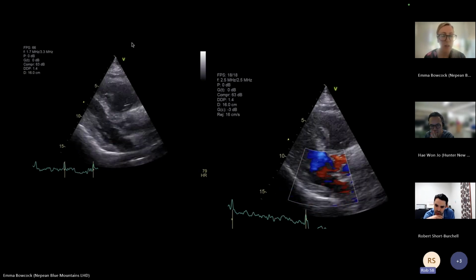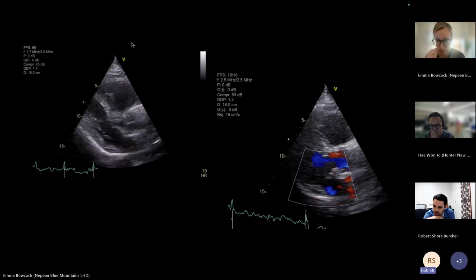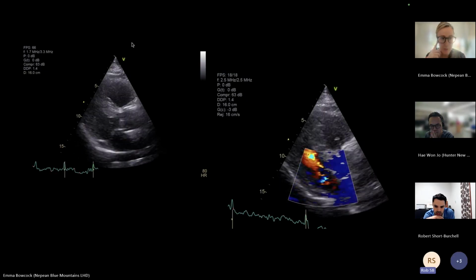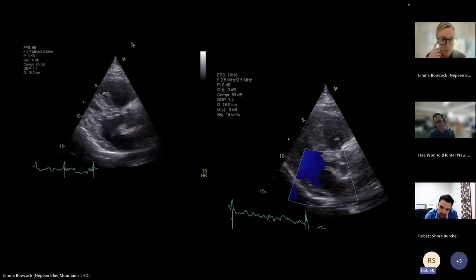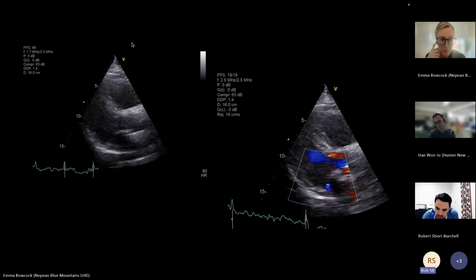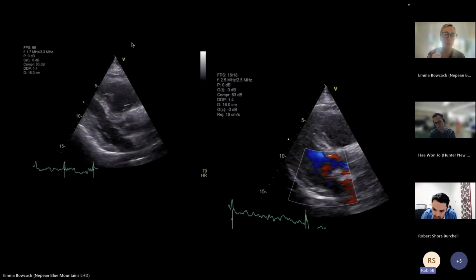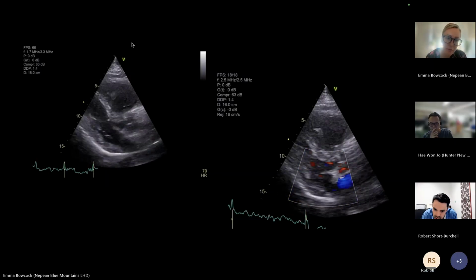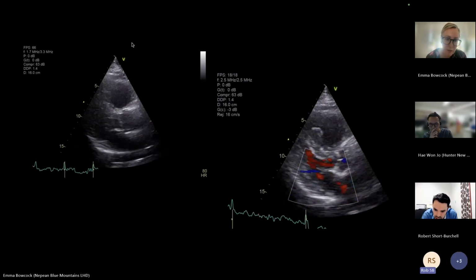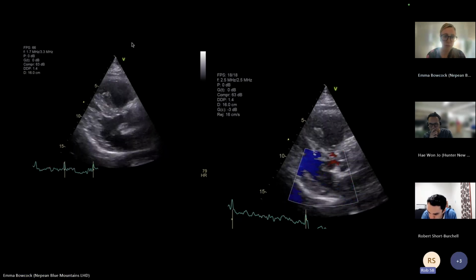All right, so parasternal long axis. The standout feature to me in this imaging is that the LV appears hyperdynamic. The imaging appears to be on axis, but I'd like to see the LV in other views. The RV is dilated, and the RVOT is much larger than the aortic root and left atrium.